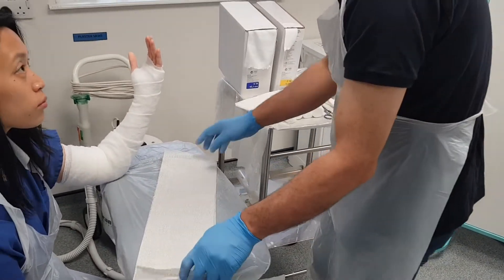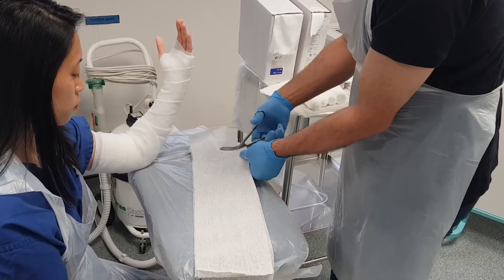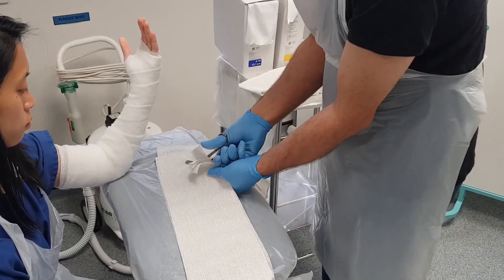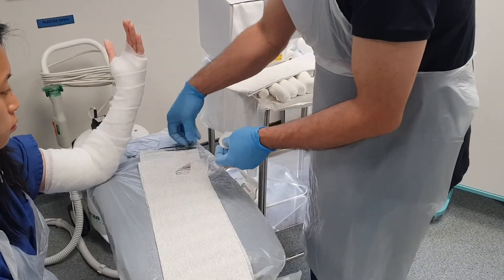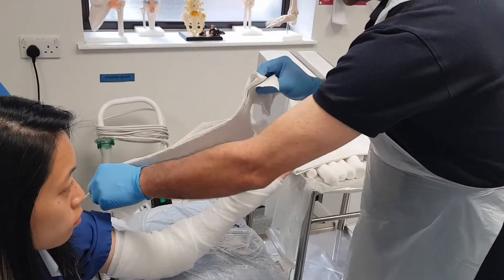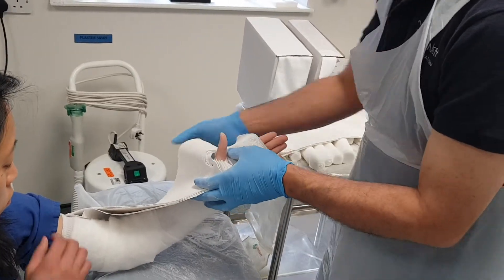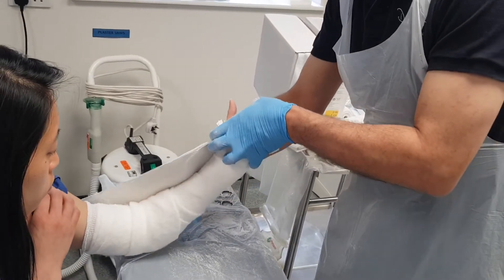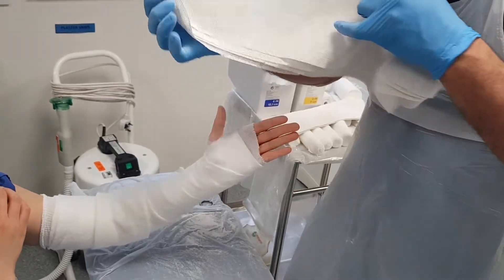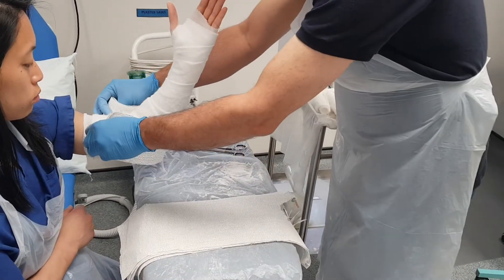I'm going to fold it to make a hole for the thumb. That's going to go around and underneath the back and up to the above-elbow area, and that's going to be much more conforming once we let it set.